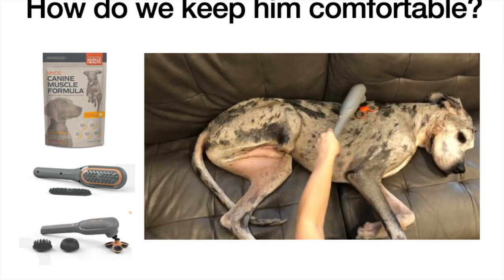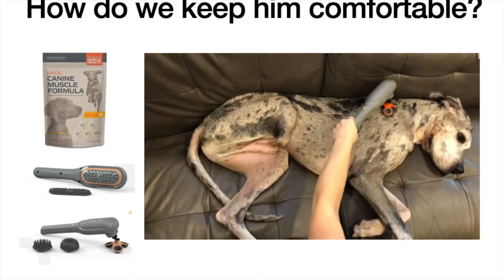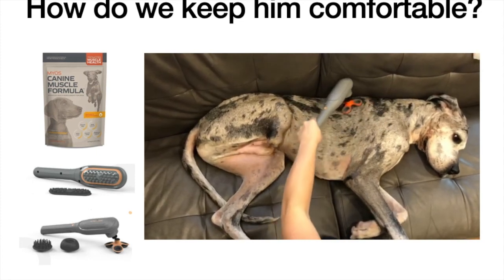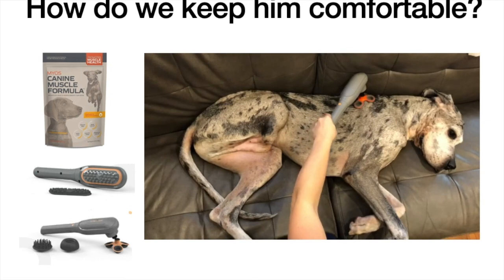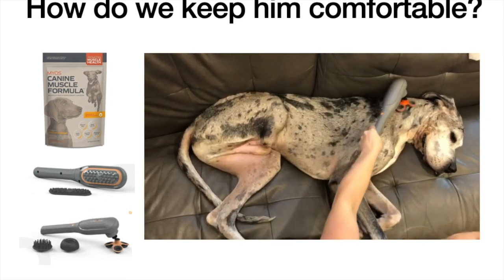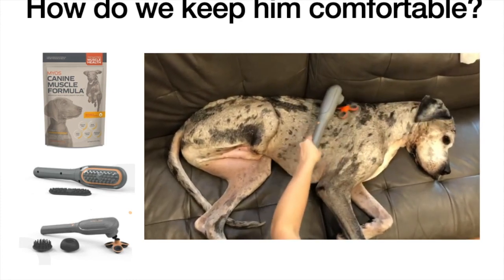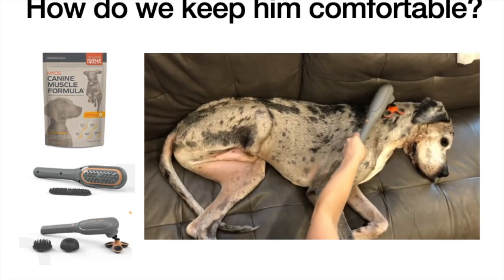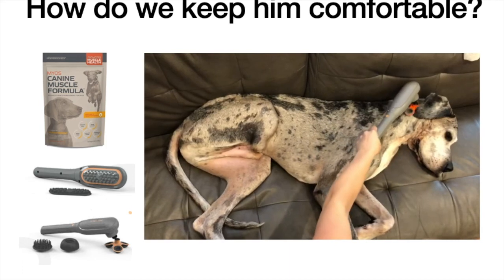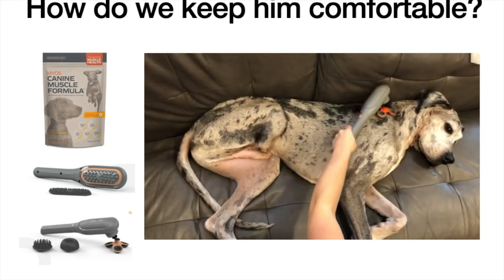You can see he's moving his legs saying, hey, I want some more of that. And so they tolerate it quite well. There are different heads that go on this device for different areas of the body. But you can see Armadi's just sitting here chilling. We've even used it on our cat. Once they get used to the sound and the feel, they're like, oh man, I really enjoy this. And especially with the dogs that have had amputations, we're trying to keep those muscles functioning, comfortable, reducing trigger points and spasms. Really something that we want to consider.